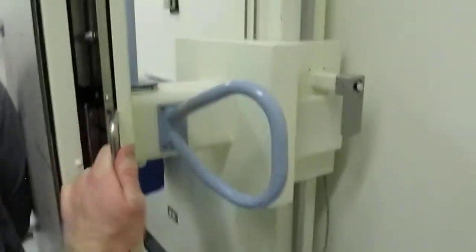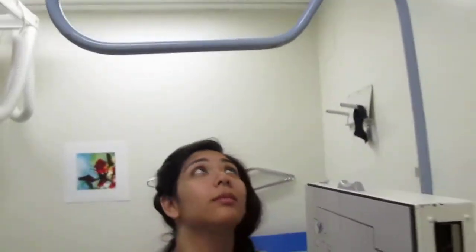So Jane, will you turn and face me with your left side against the board? And I would go and I would place this into the reader and pull it up. And I would come back in position for a lateral. So we have a 14 by 17 lengthwise. Okay, Jane. So for this one, I'm going to ask you to grab a hold of that pole with both your arms and come closer over to the left, touching the screen, and I would go ahead and position there.